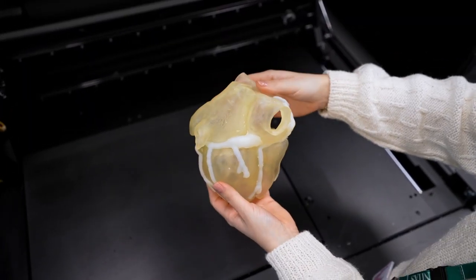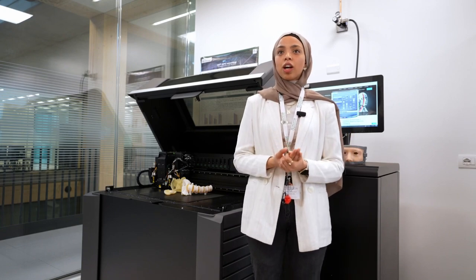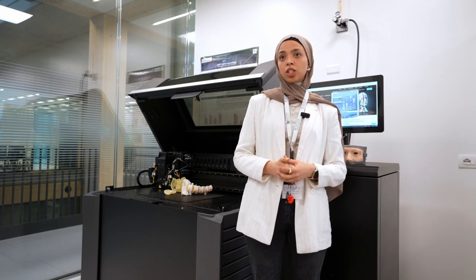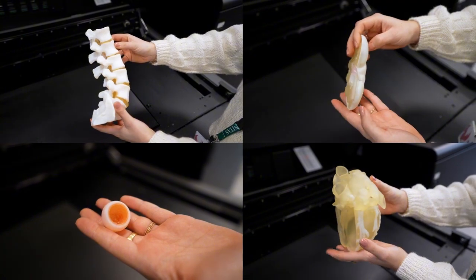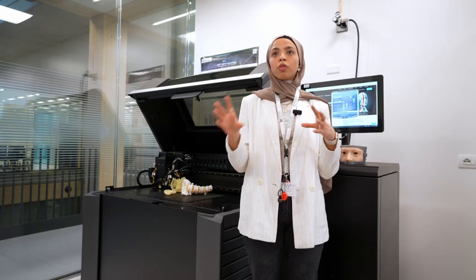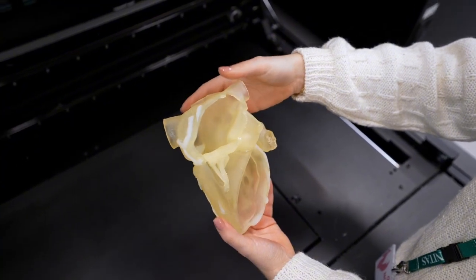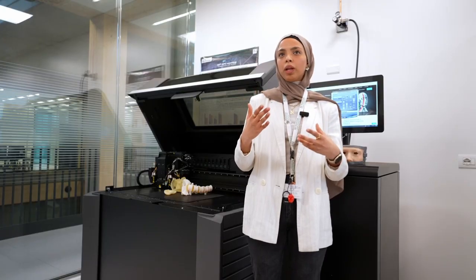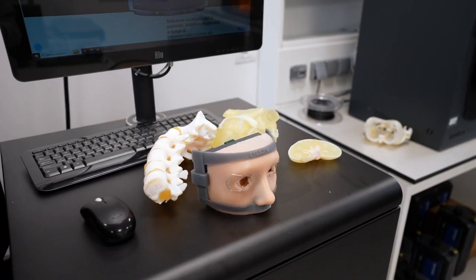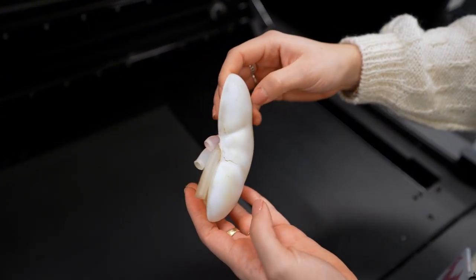For the choice of the material, we have printed a lot of samples, so when the surgeon comes and delivers us his request, we present all the samples and they decide whether to choose one of the presets we have or to create a new material by choosing the texture and the consistency of the material. Then we print different samples based on the request of the surgeon, and when they touch them and understand the various materials, they choose the perfect one for them.